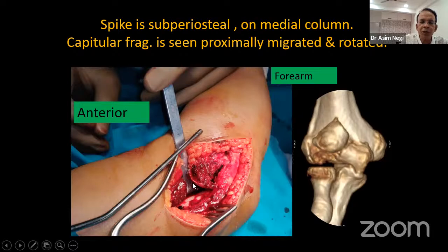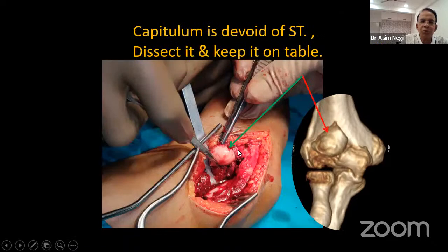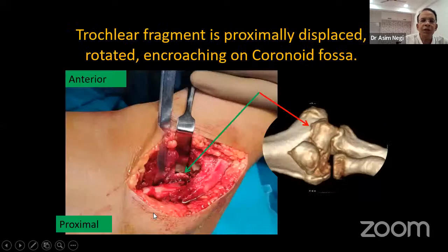Capitular fragment, now you can see, is proximally migrated, rotated, encroaching on the coronoid fossa. This is the CT image of this bony piece. This capitulum is practically devoid of all soft tissues. So dissect it and keep it on the table. Unless you do that, you will not be able to see the trochlear fragment.